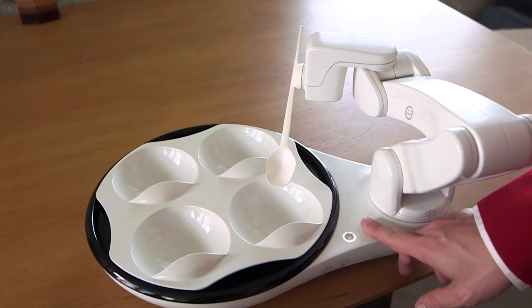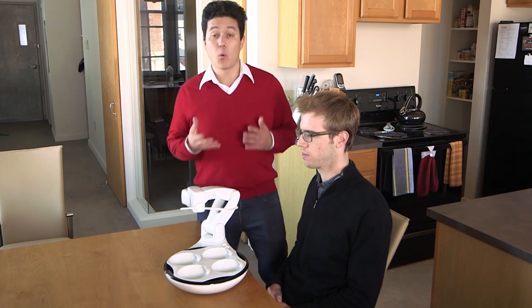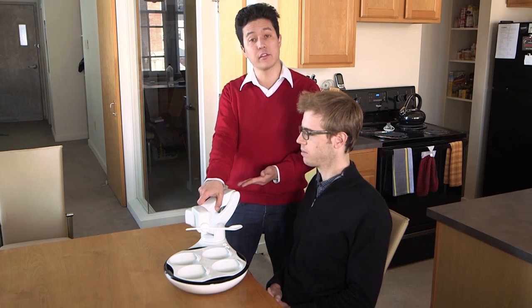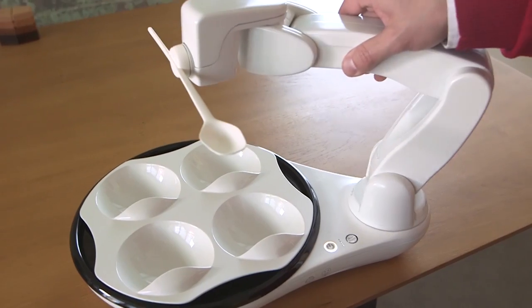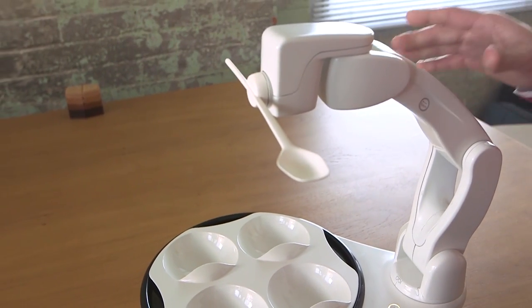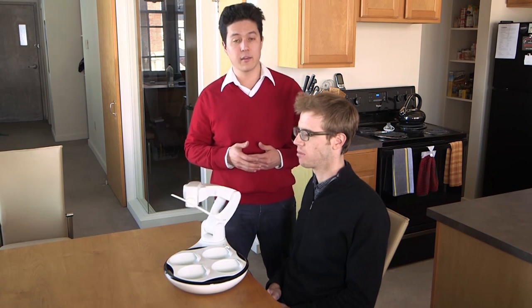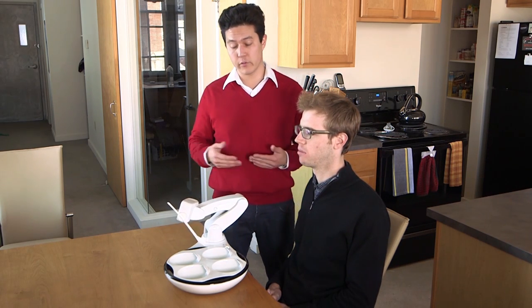Start by simply pressing the teach button on OB's base. Once OB stops moving, grasp the arm and ensure that your thumb is covering the teach icon and lift. Move the spoon to just in front of the user's mouth. Once the desired position is reached, touch the teach button again to exit teach mode and store that delivery location.